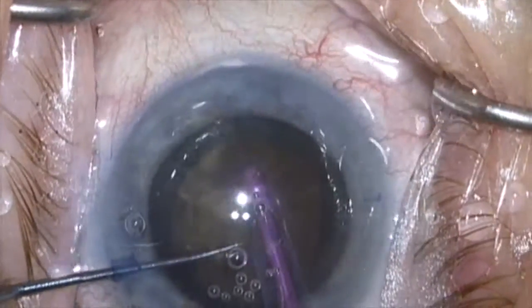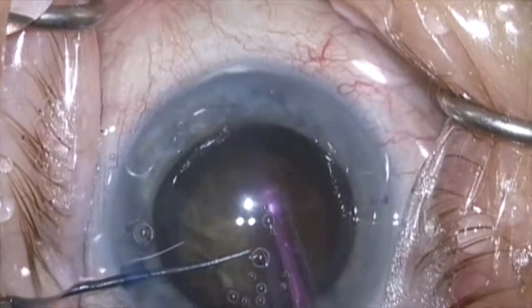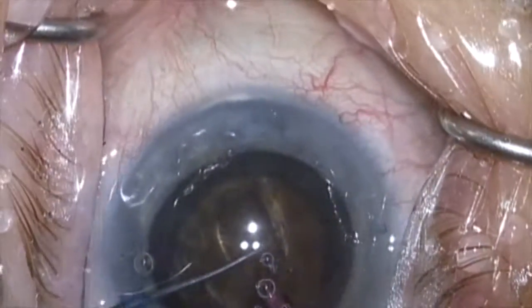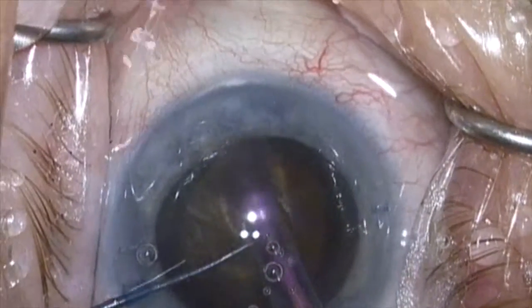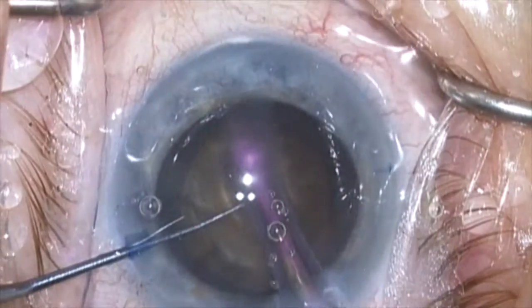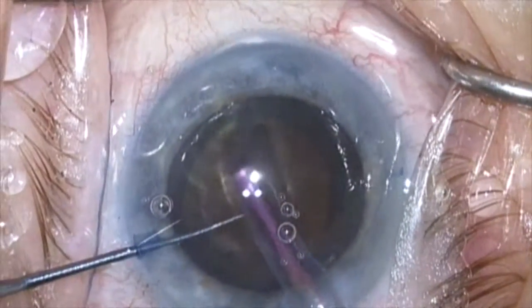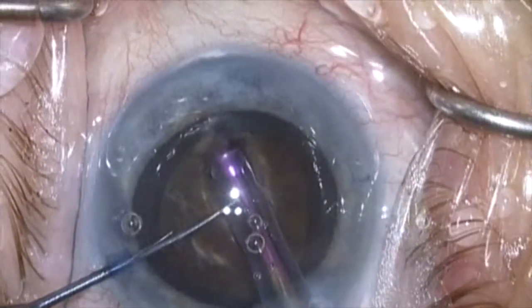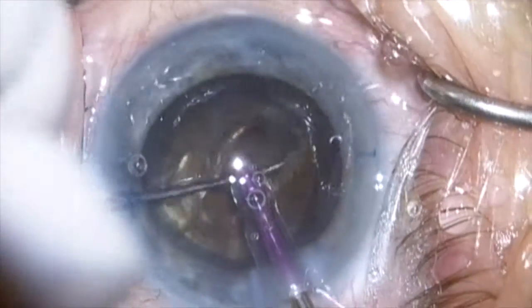Here I'm going to use a reverse slope sculpting technique with a 2.2 millimeter purple tip needle. This is a fresh needle on a Bausch & Lomb Stellaris machine. I have the power on ultrasound set all the way at 100 percent and I'm not flooring the pedal — I'm just feathering the pedal — and I'm going to do a deep, fairly wide central groove as far down as I feel comfortable going.